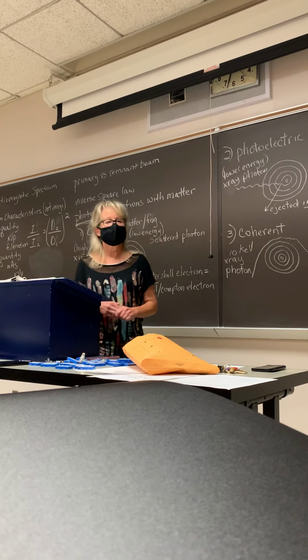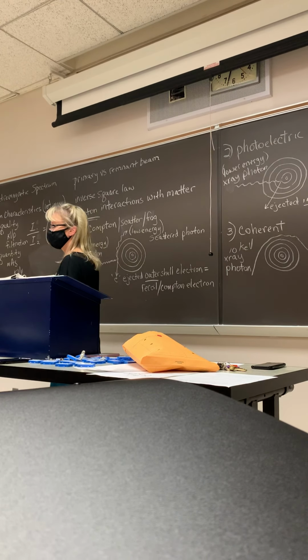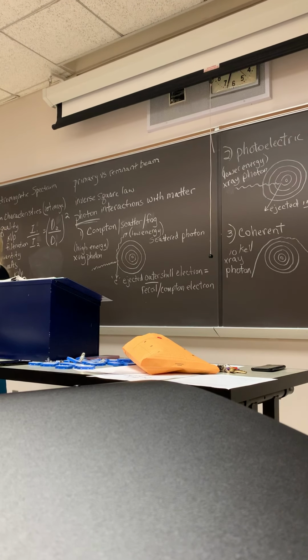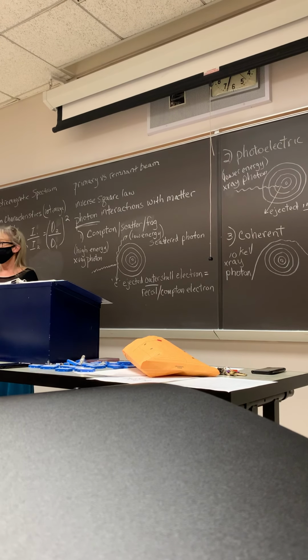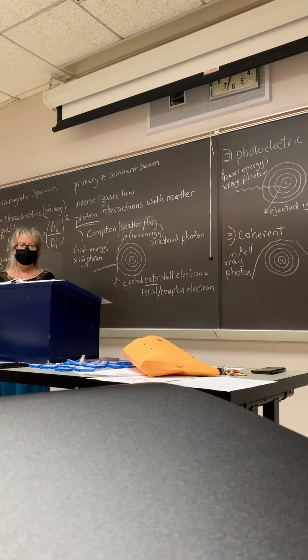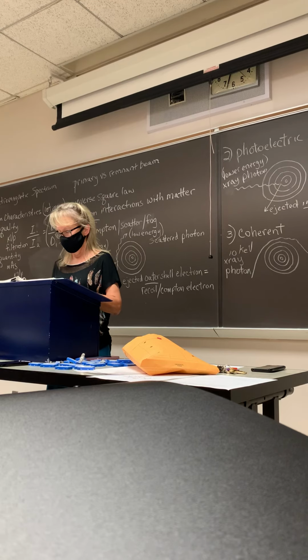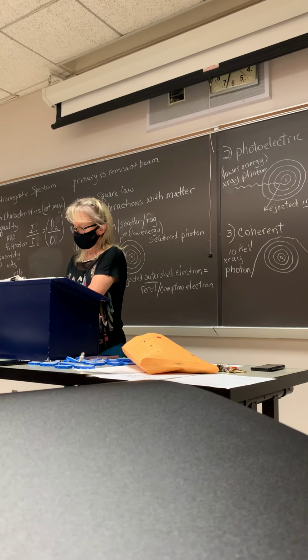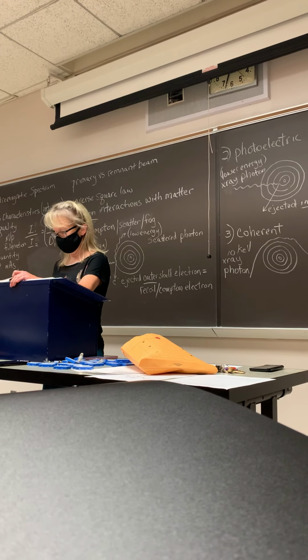Okay, fluoro timer. How long is the fluoro timer? Good, 5 minutes. What happens when it gets to 5 minutes? It beeps. Does it turn the machine off? No. It just beeps. I'm going to talk about the automatic brightness control some other time. I think it's in the spring, can't remember.